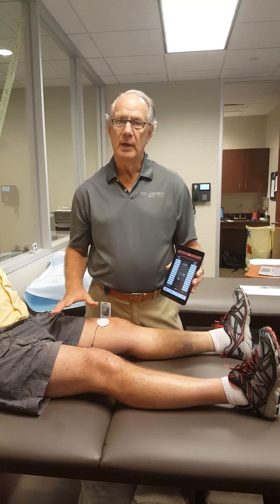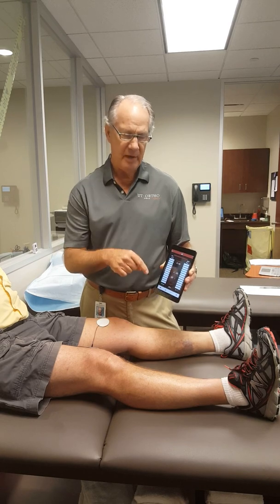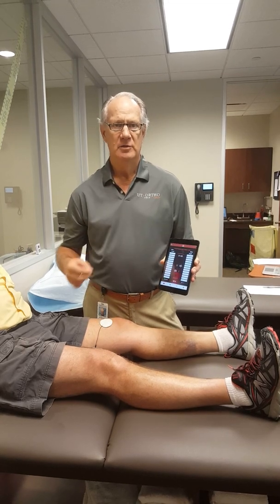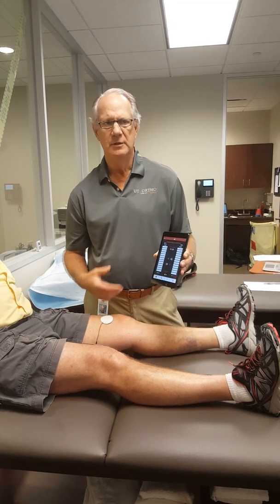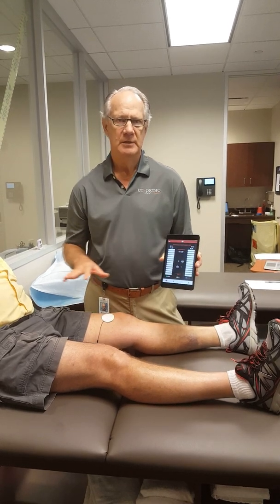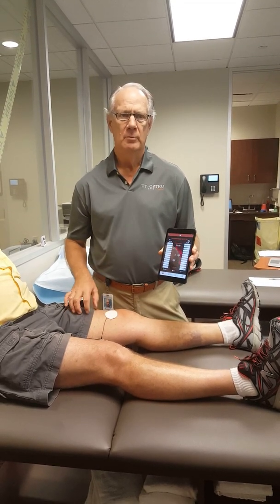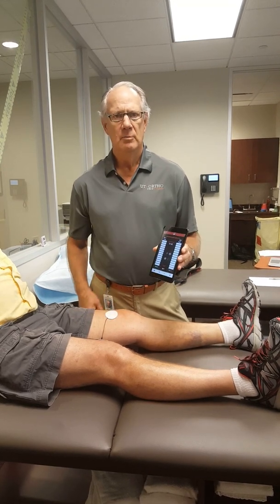This is not measuring strength — this is actually measuring your EMG activity. And for me, that's why biofeedback is better than muscle stim, because you can actually measure, especially with our device, how the patient's doing neurologically. And until you get this back — I predict probably in three or four weeks you'll have this back to 100% of normal. This is one way there's no other device in the clinic where you can measure EMG activity, because it's all about recruiting all these little motor units. The more motor units you have, the more EMG activity and the bigger your muscle can be.